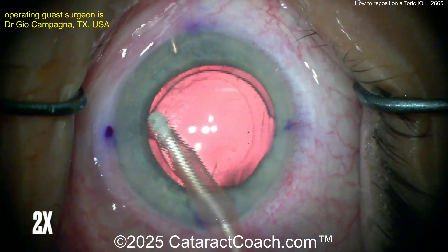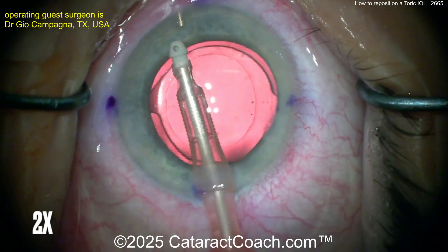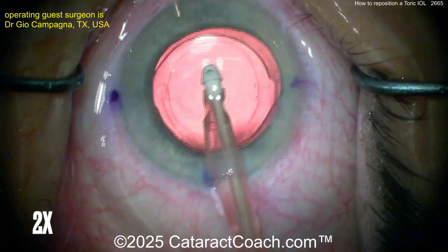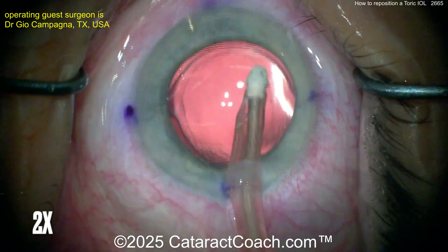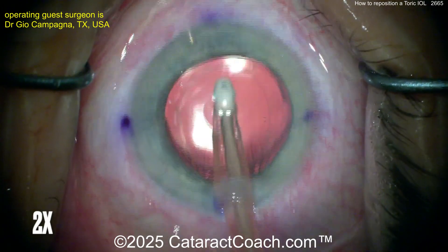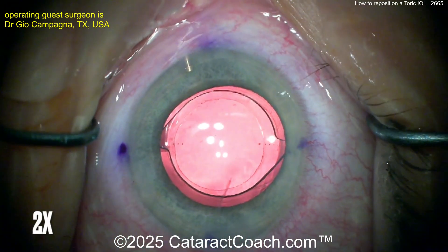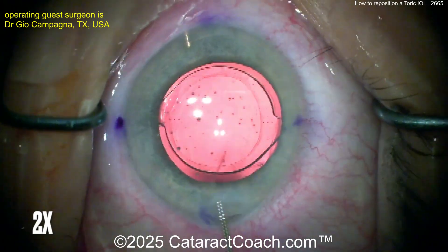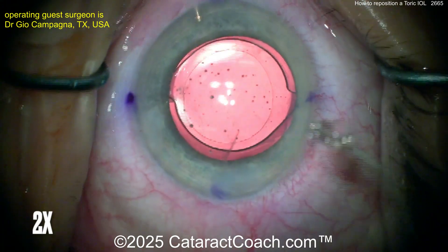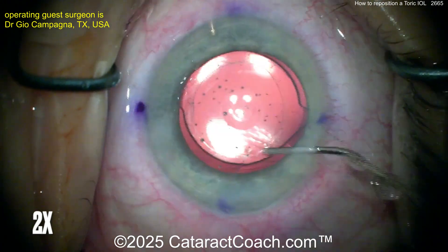Was that a glaucoma stent there nasally? I think your glaucoma stent's popping out — look at that. I just didn't notice that until now. So maybe that's going to need some repositioning as well. But now we've got the toric lens at the appropriate alignment. That raises a whole other question: should you be putting in an EDOF lens in a patient who has enough glaucoma that it requires a stent? Let's put some viscoelastic, put up a gonio and take a look — maybe you need to adjust it a little bit.